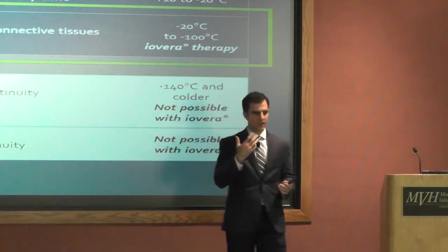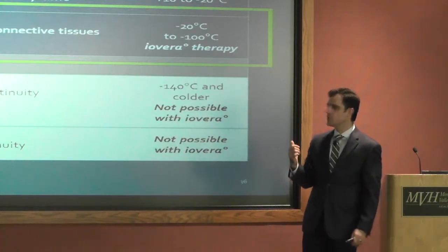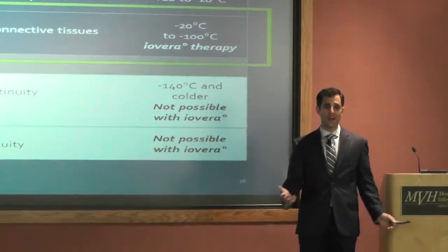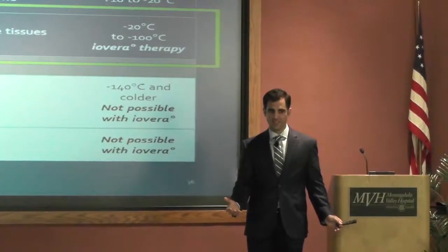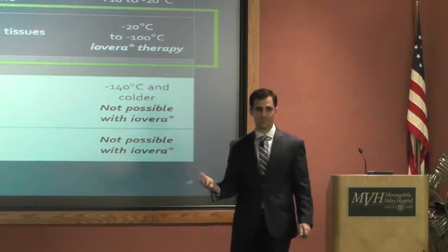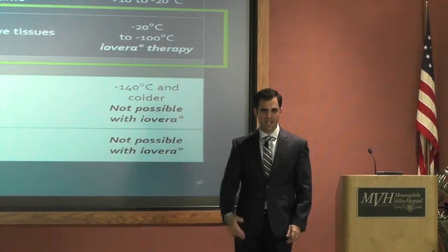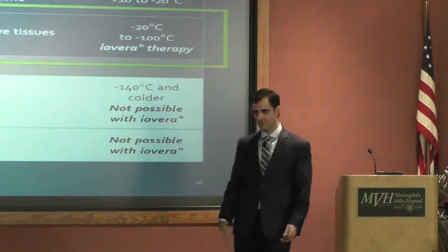It's in the face area. It can be used for that. This was originally made as an alternative to Botox treatments. So people that get Botox to help with wrinkles around their face, this was originally used for that. But they found that pain got better when they used it, and then kind of went along that route.